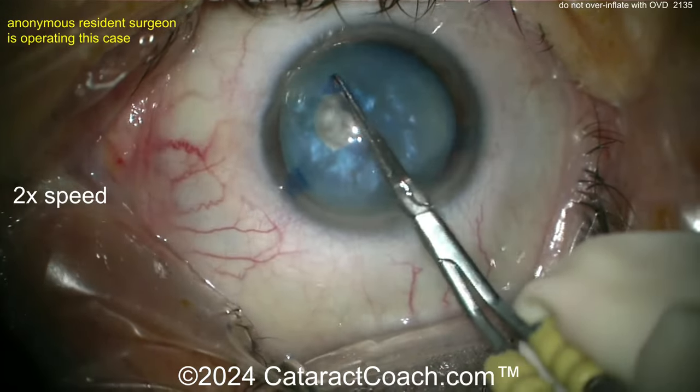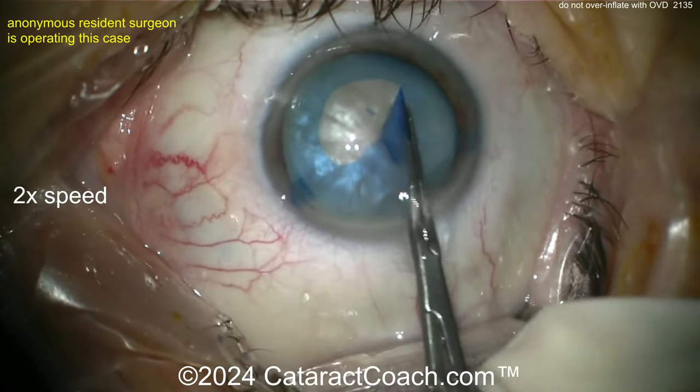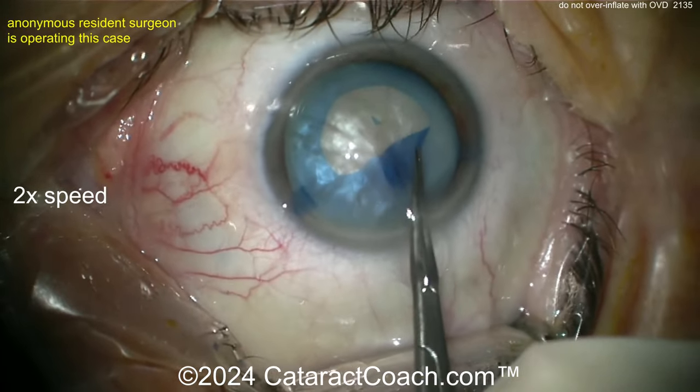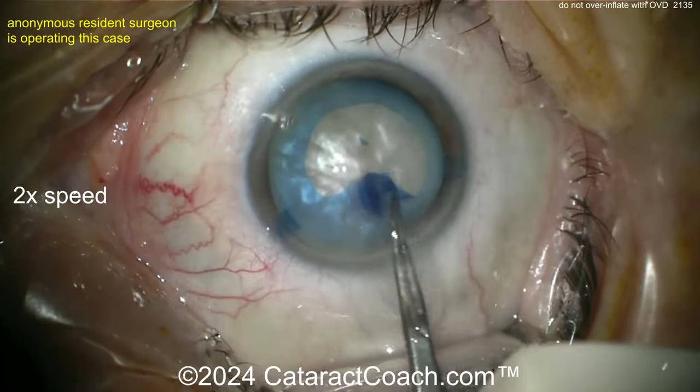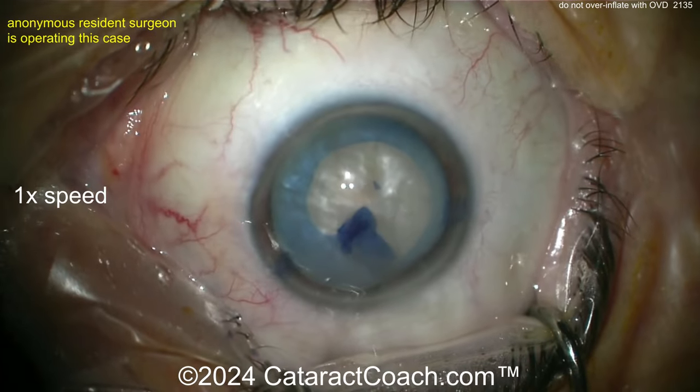Now going over to the capsulorhexis forceps, getting the rhexis completed. That looks pretty good. Now keep it going. Now the little bit of loss of viscoelastic from the incision is going to cause the AC to flatten a little bit. And now you see the rhexis wants to run out.